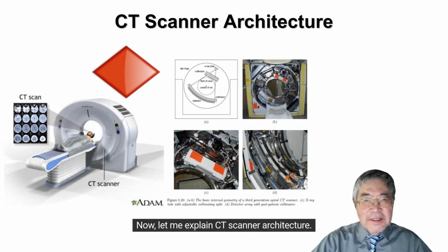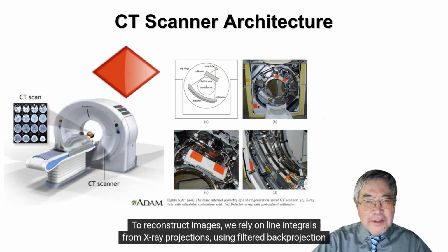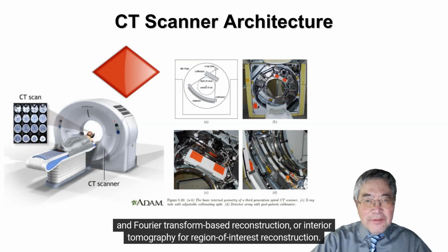Now let me explain CT scanner architecture. To reconstruct images, we rely on line integrals from X-ray projections using filtered back projection and Fourier transform-based reconstruction, or interior tomography for region of interest reconstruction.